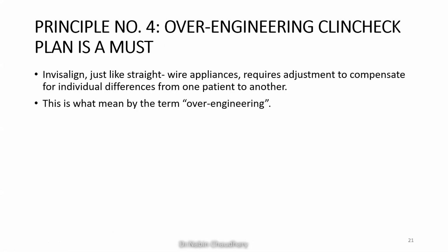Now another principle is that an over-engineered ClinCheck plan is a must in the case of clear aligners. Over-engineering means that, just like the straight wire system, different adjustments are required from patient to patient. Each Invisalign system should have individual differences which will move the teeth into the desired position.